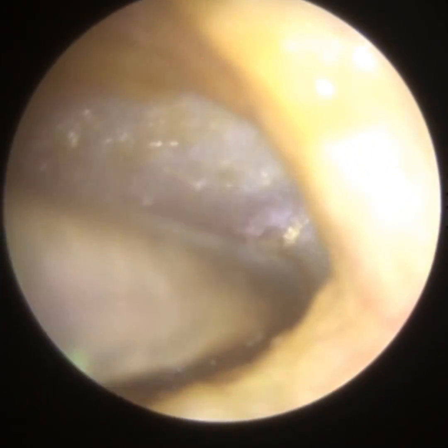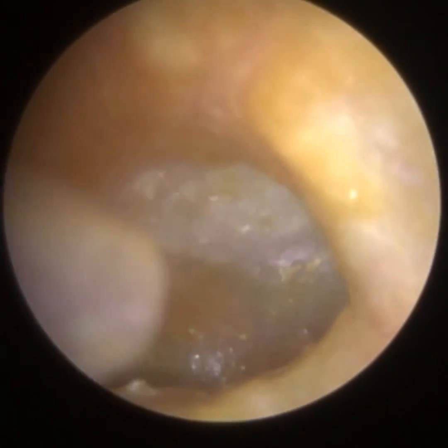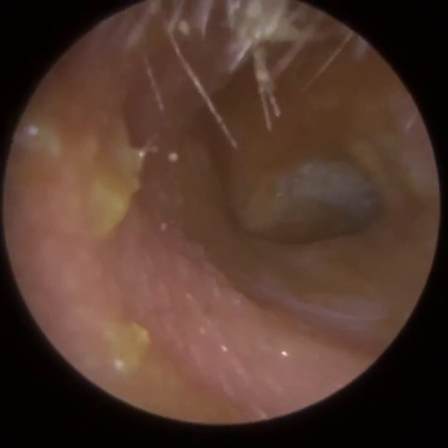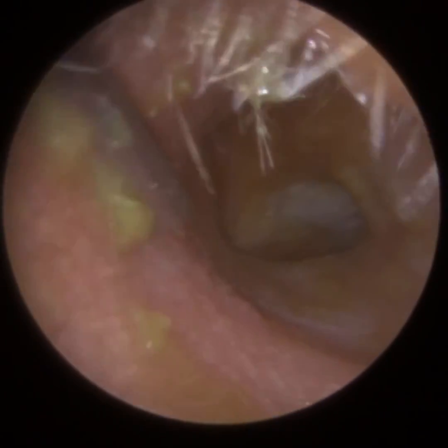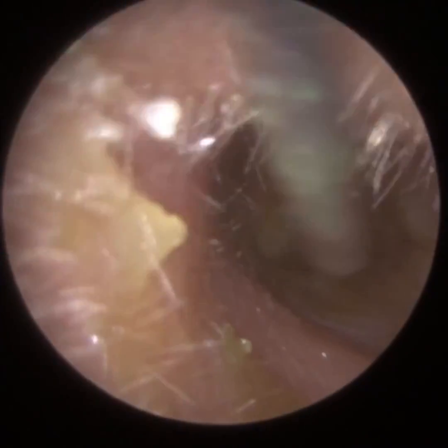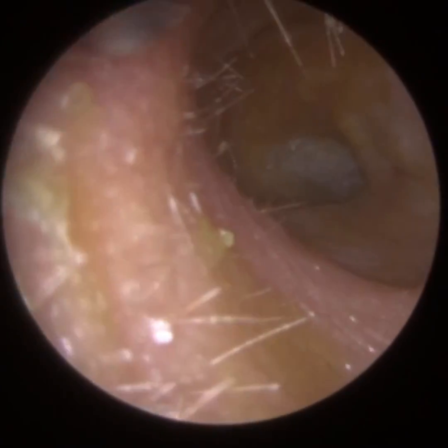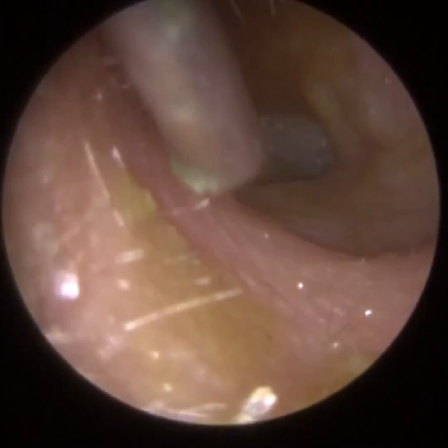And it is a very tedious procedure. I'm just thinking about some of the Clearwax delegates we train. Would I expect them to do this in the first instance? No, because it is quite complex. You're making contact directly with the eardrum, and also we're trying to remove all this debris off the bony part of the ear canal. So it is a very tedious procedure.